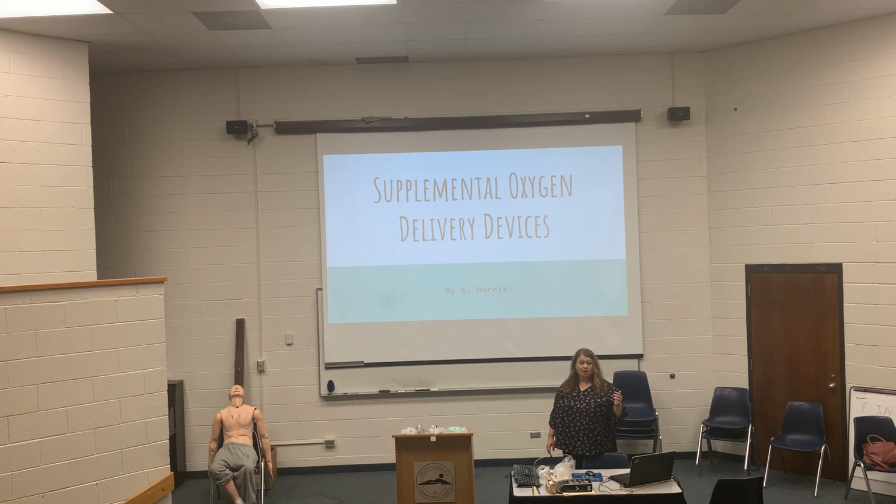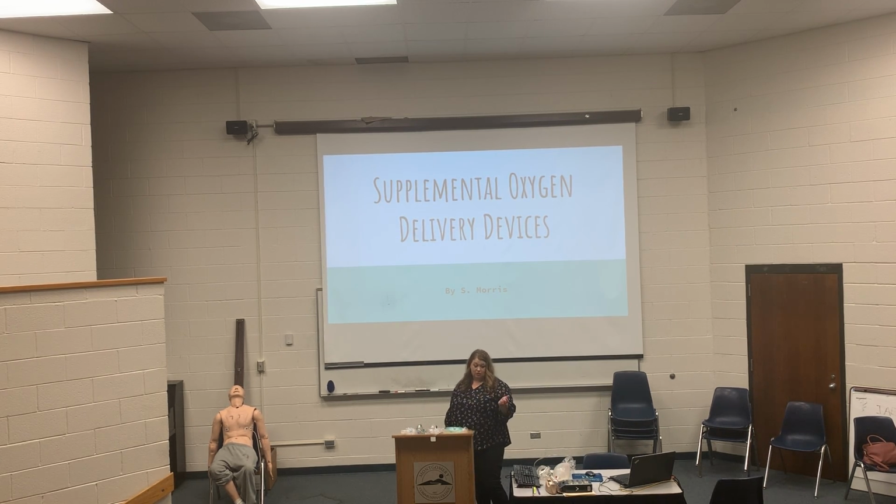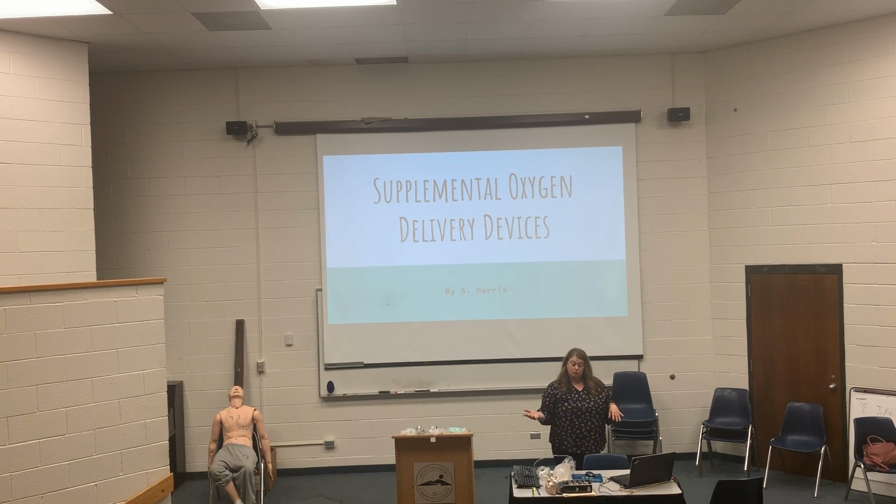What to use and when. I want you guys to feel confident and comfortable in what it is. And remember that there's not always one right thing. You can try one way. Maybe you say, hey, I'm gonna put a nasal cannula on and they still got oxygen saturations of 70, so then you switch up to a non-rebreather. But I want you to know which does what it's for, and how much oxygen it delivers.